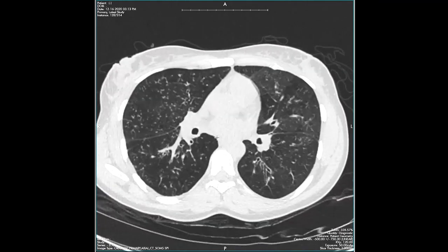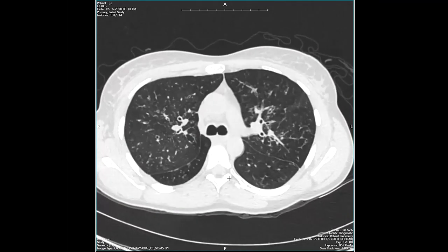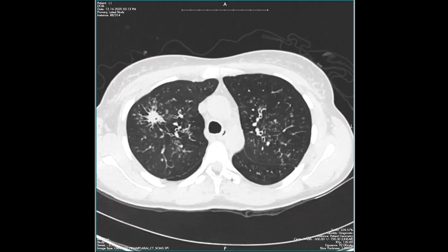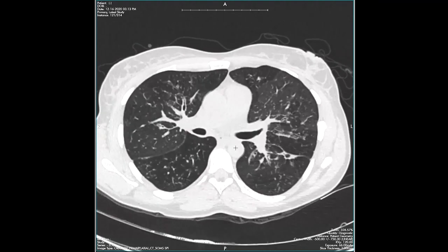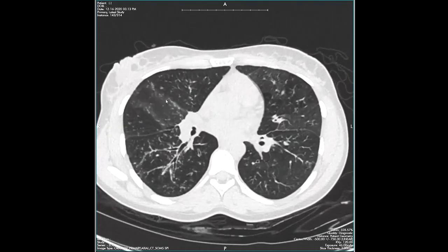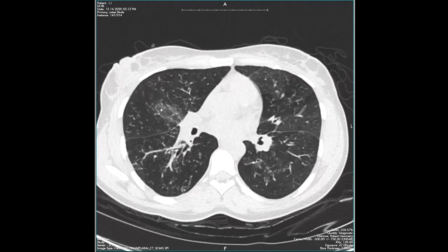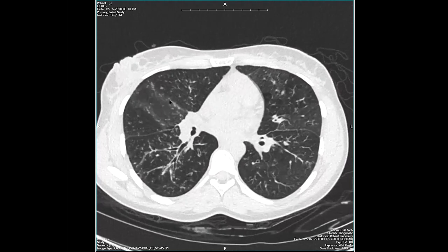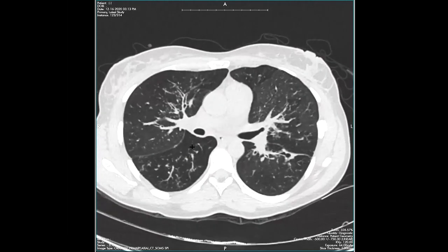Could this person also have a little bit of centrilobular disease, like a small airway infection? That's possible. But when we see all this fissural involvement, that really should point us more towards either a perilymphatic or a miliary process.